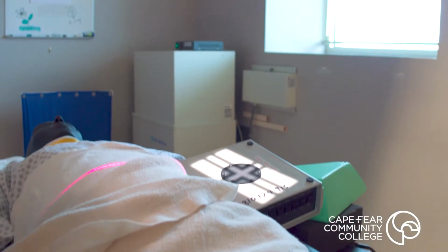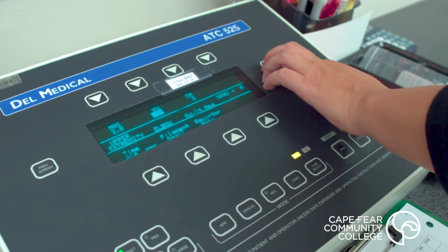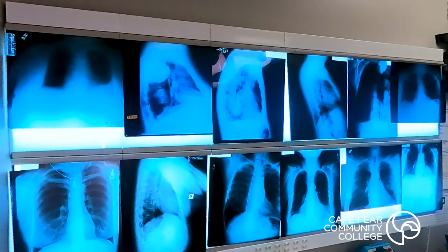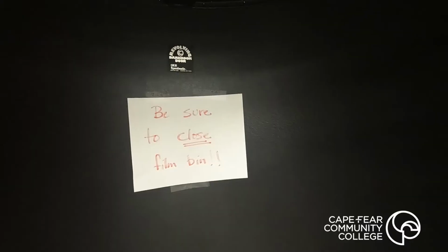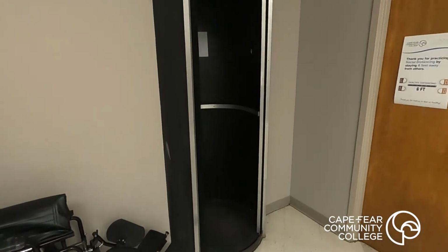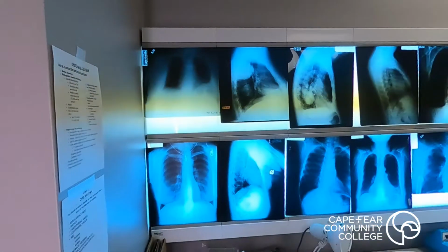And we also have several imaging courses. In these instances, the students actually produce X-ray images using our various phantoms in order to see the results of technique selection and positioning. Our imaging consists of three primary methods. As you can see on these light boxes, we have film with a darkroom. We don't use that in a medical setting these days, but we have the capability to reproduce images using film, which helps the students understand the functioning of various X-ray power techniques and power levels.